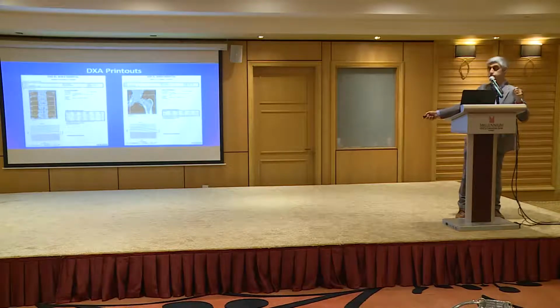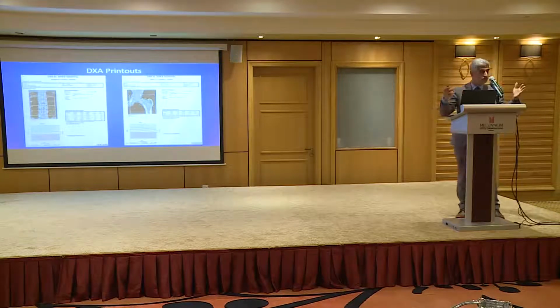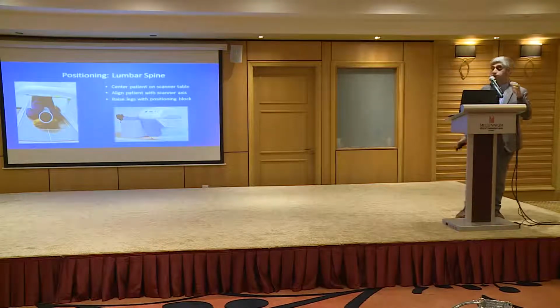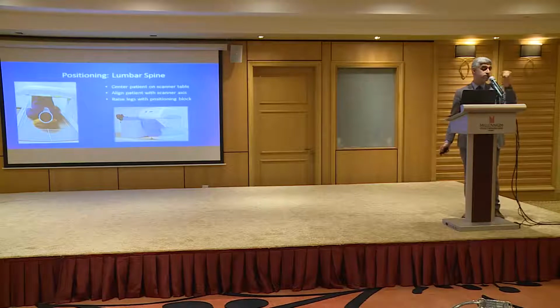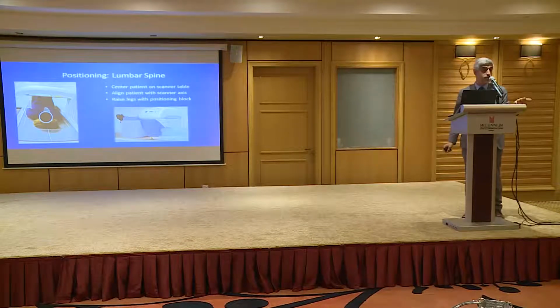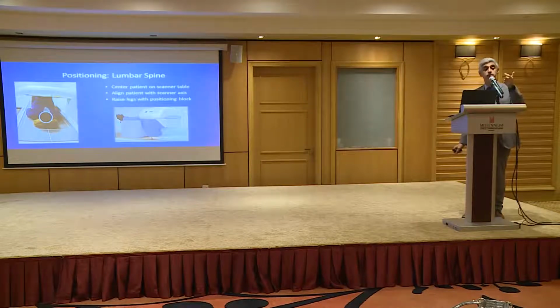Then you have three important parts, which are the image of the X-ray, the detailed DEXA scan results, which we'll go through, and then the graph to estimate the risk of fracture if that's needed. So positioning is very important to have a successful DEXA scan reading, because without appropriate positioning of a patient, you will have either a distorted image or even a BMD value, or a DEXA scan value, that is not correctly labeled.